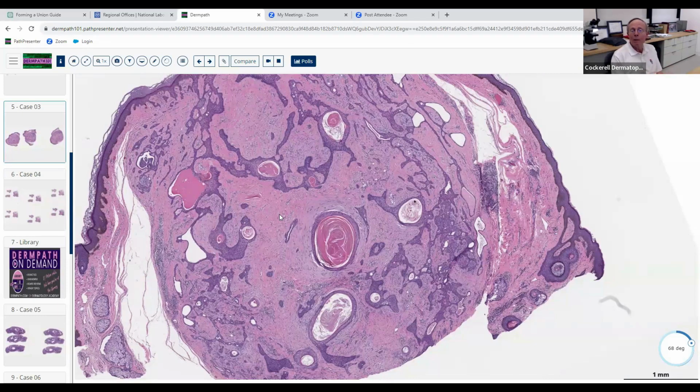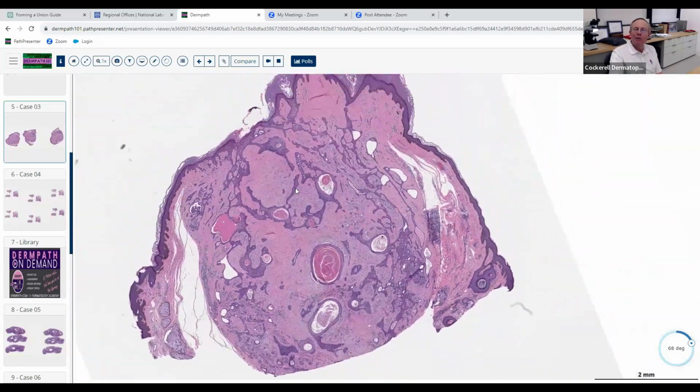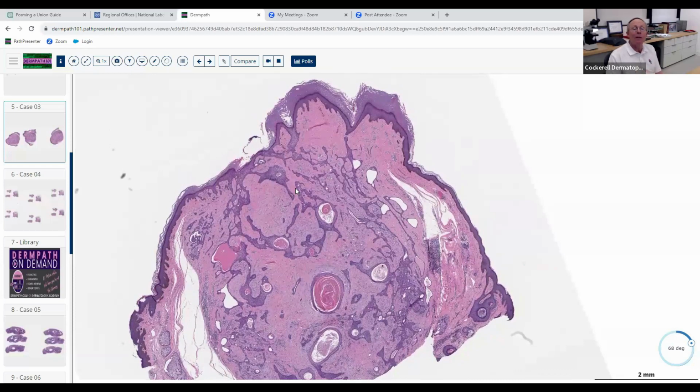So these adnexal neoplasms often have both a stromal component and an epithelial component. It's like a seed and soil kind of thing. You kind of need both. It's like a nevus sebaceous or some of these epidermal nevi. If you go in and just shave them off or dermabrade them or whatever, and think that you're going to cure the patient of it, you're not going to, because they've got this non-epithelial component that sort of feeds it. So this is all part and parcel of the lesion here, the fact you've got the stroma and the epithelial components.